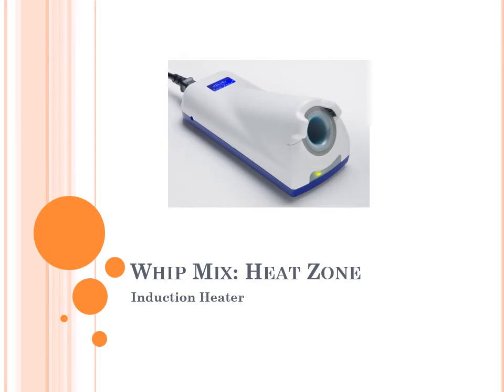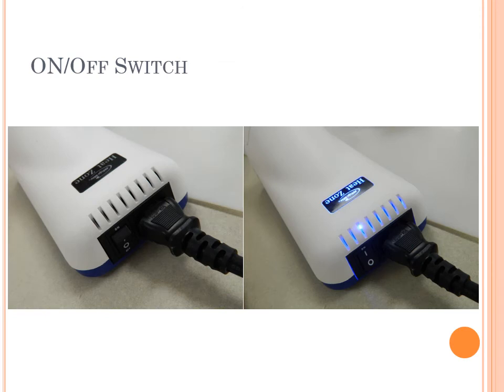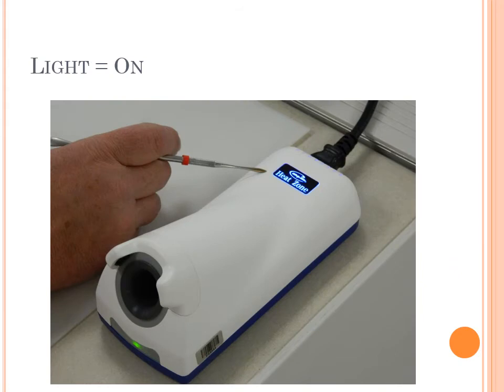We'll start with showing you how to use your Whip Mix Heat Zone induction heater, which is assigned and attached to each of your benches. In the back of your induction heater, you will find an on and off switch. When you flip that on, a blue light will indicate that it has turned on. From a front view, you can see that the logo is glowing blue, and you also have a green light in the front bottom there that shows that it is ready and working.